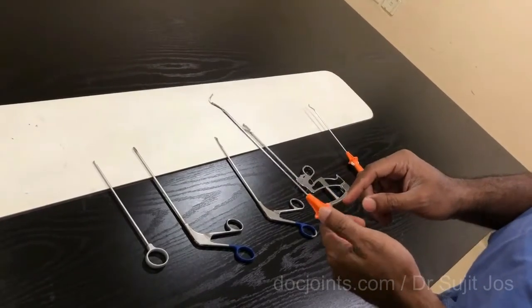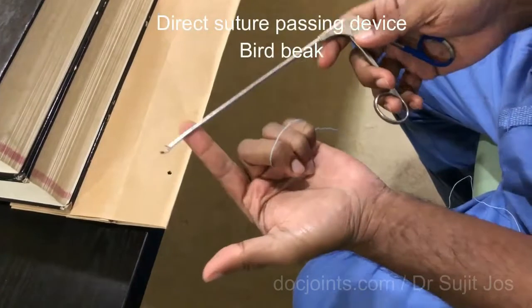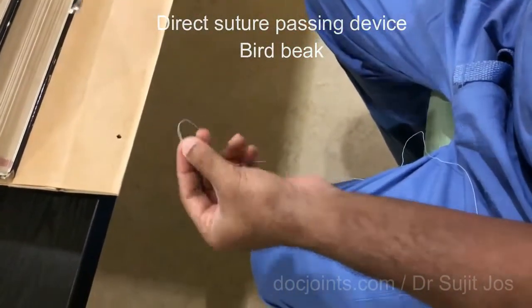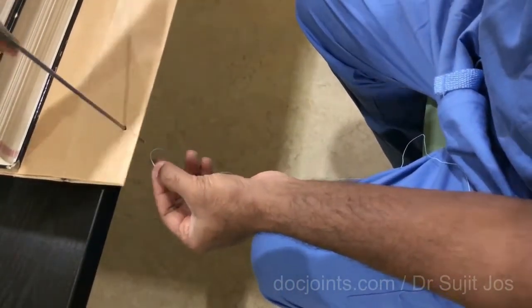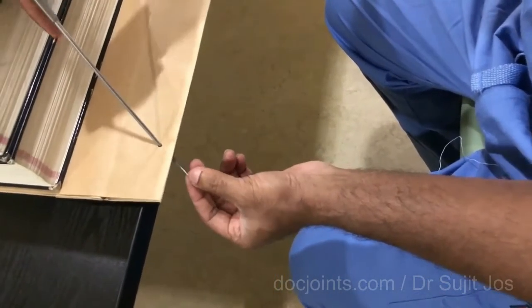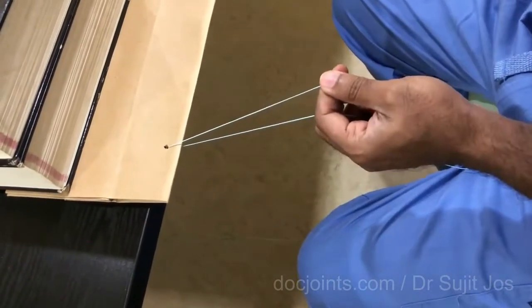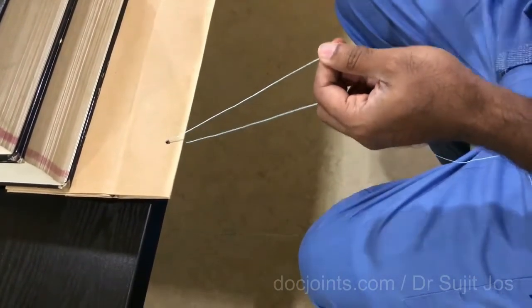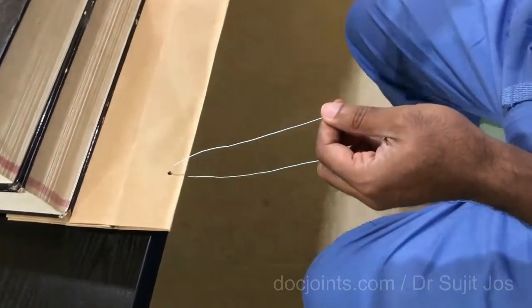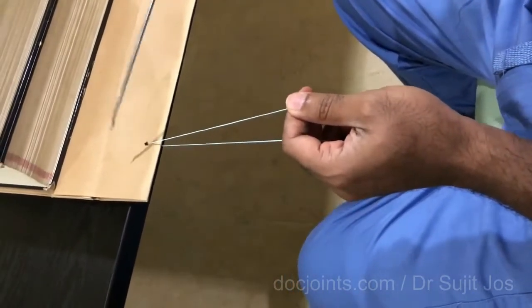We will demonstrate how each one is used. That is a bird beak or direct suture passing device, which is used to pull a suture using the eyelet at the end. You open the mouth, close it and pull it out. It's pretty simple and straightforward but it's difficult to manipulate sometimes inside the closed or tight spaces inside the shoulder.